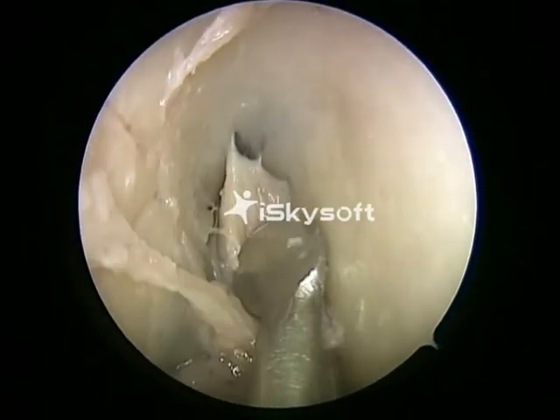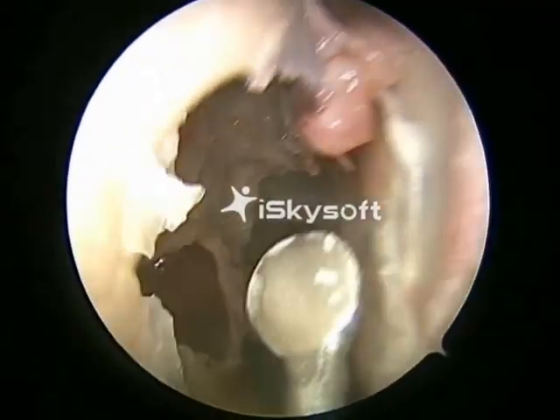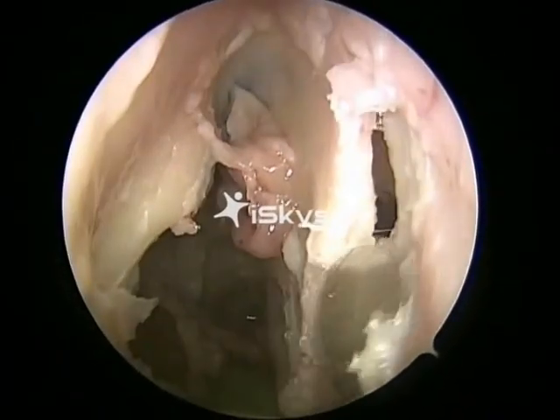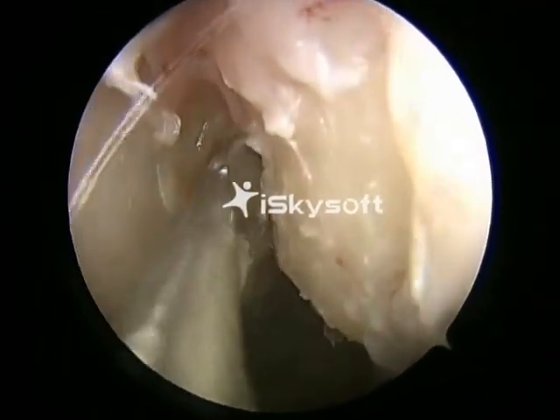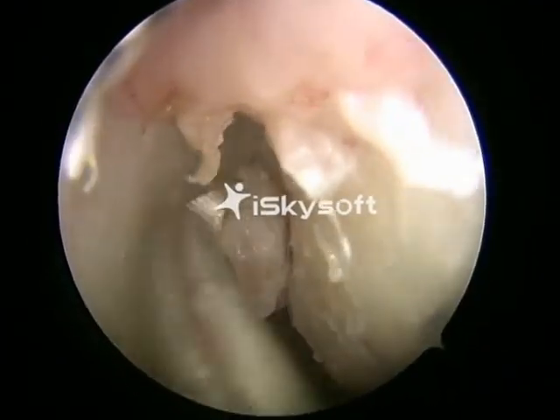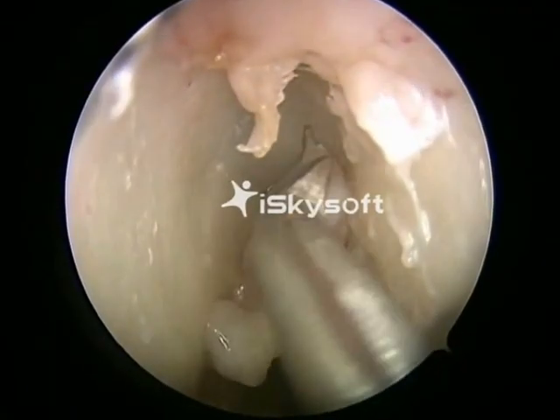That's the first olfactory neuron. That forms the posterior limit of dissection. The same procedure is repeated on the left side. The mucosa of the middle turbinate and the septum, and that's the first olfactory neuron.